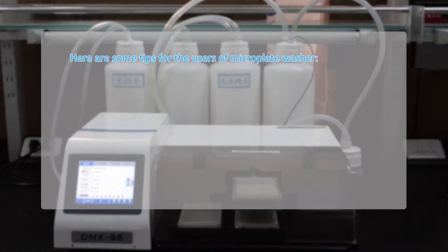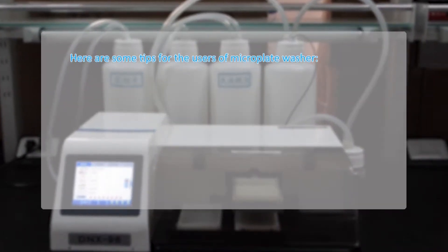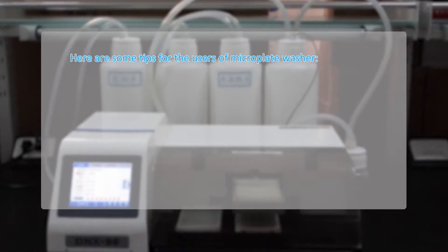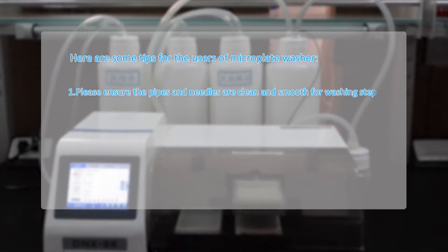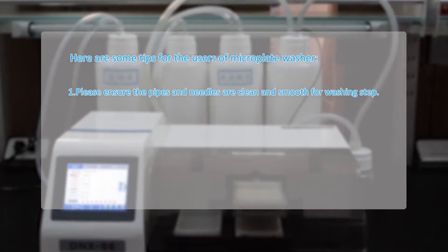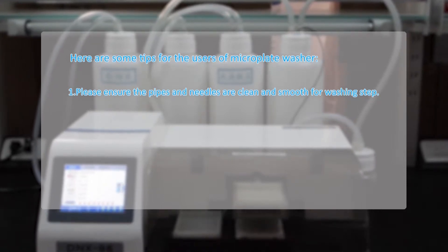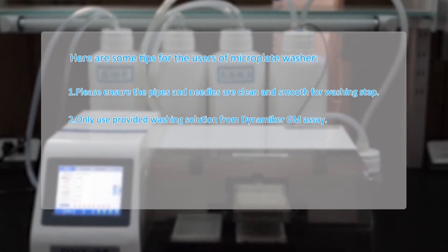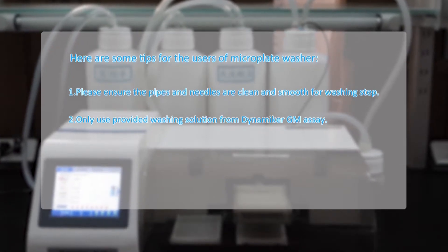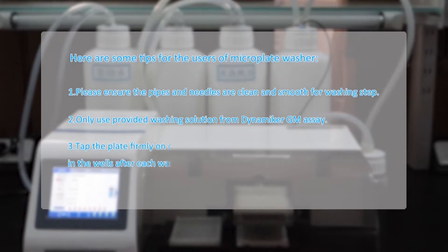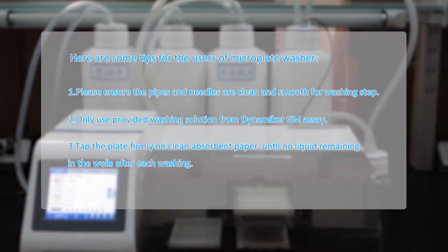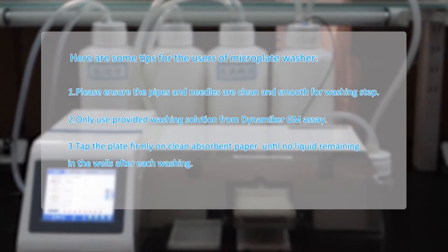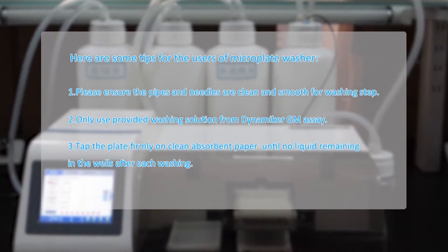Here are some tips for the users of microplate washer. First, please ensure that the pipes and needles are clean and smooth for washing step. Second, only use provided washing solution from Dynamiker GM assay. Third, tap the plate firmly on clean absorbent paper until no liquid remaining in the wells after each washing.